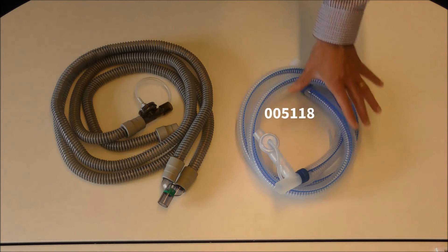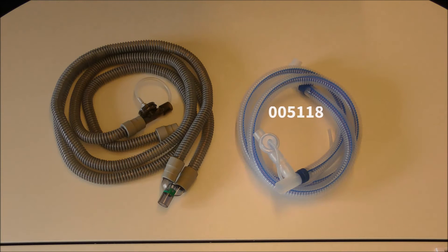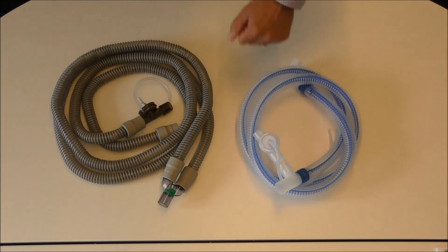The disposable circuit has two channels in the tube. One channel leads the air to the patient and the other channel leads the air away from the patient to the exhalation valve.